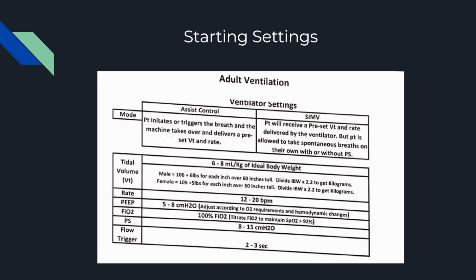Your COPDers and your asthmatics who have a high CO2 level, if you're putting them on the vent, you're actually going to need to bump their rate up a little bit so you can breathe off some of that CO2, but be careful that you don't hyperventilate them and breathe off too much. This is where you're definitely going to want to have some capno hooked into the vent, okay?